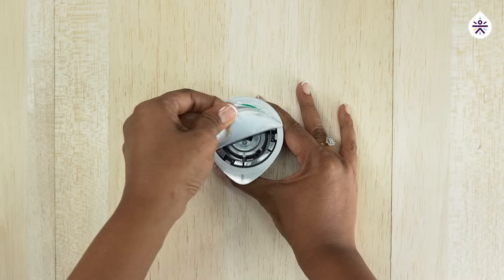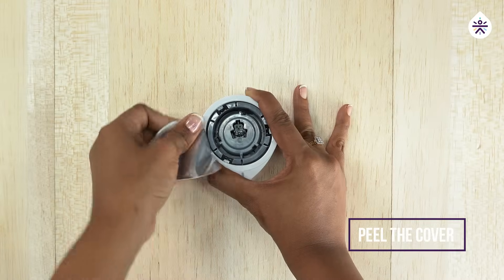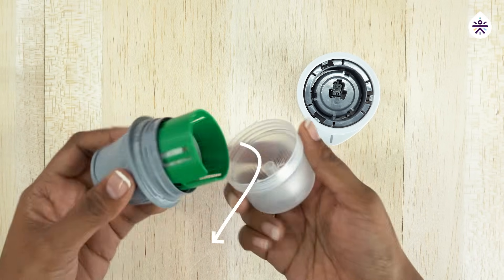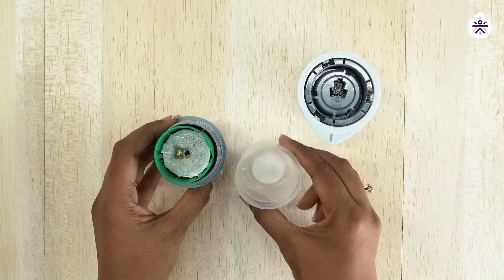To begin with, let's peel the cover of the sensor pack. Next, unscrew the sensor applicator. Now take the applicator and place it on a table.